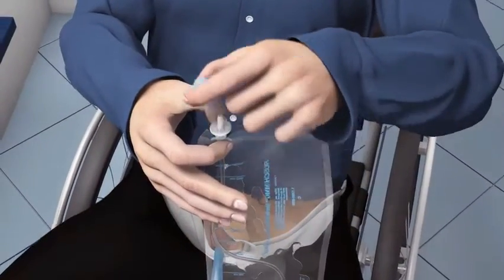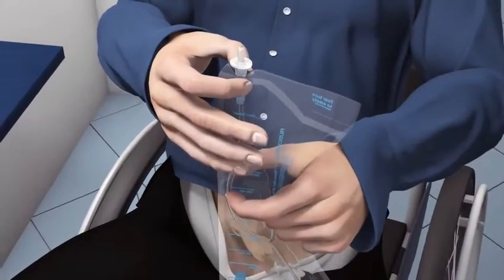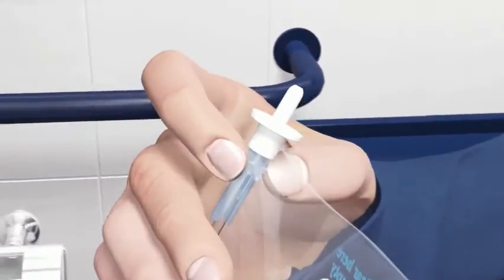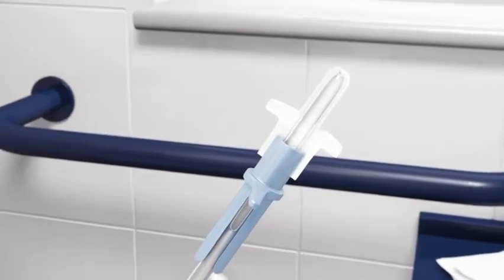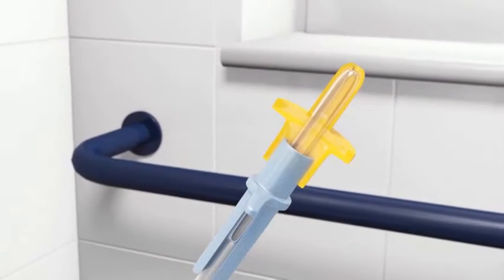While holding the split introducer guide in one hand, feed the pre-lubricated catheter tip forward until it is about to come out of the flexible introducer tip. This helps give the introducer sufficient firmness to enter the urethral opening. The catheter should now be loaded into the tip so that the tip is firm.